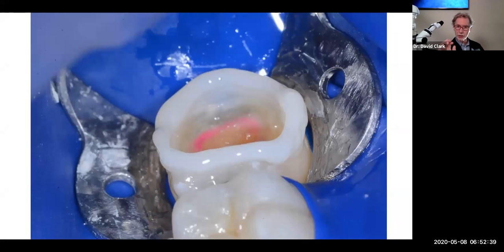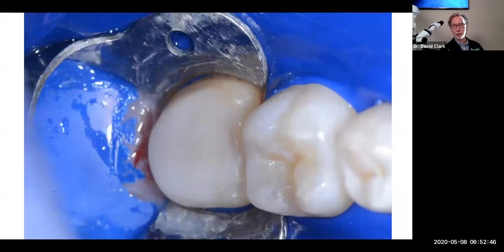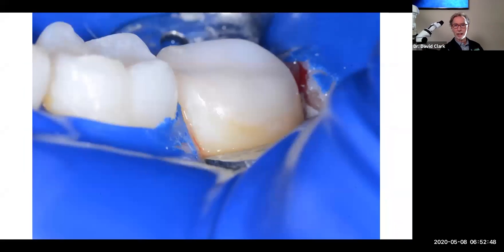It's going to allow me to injection mold with resistance. So John, there's the curb again. You see, it's a big deal. There's my helmet. I put the tooth into compression, cuspal overlays on the distal. I'm not going to get crazy with a bunch of sharp, spiky anatomy that could break off later.